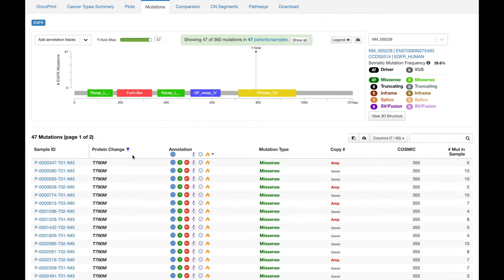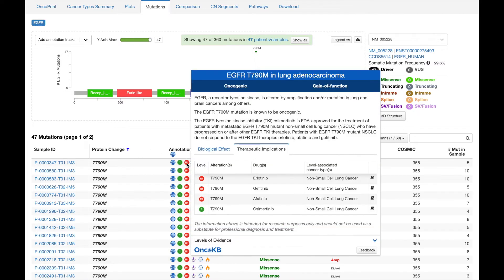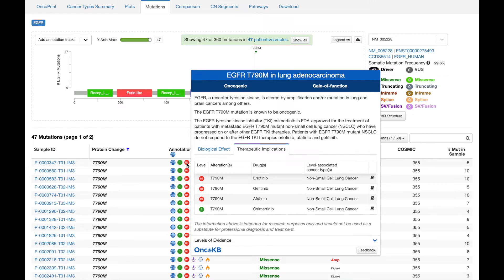If we look at the next column over, we can see that according to OncoKB, these T790M mutations are associated with resistance to a number of EGFR-directed therapies, which raises the question, did these patients receive anti-EGFR therapy?